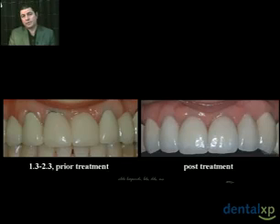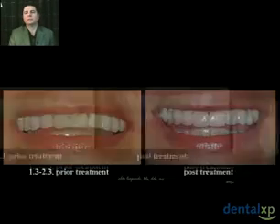In this example for this patient, she has bridge work from 1.3 to 2.3. We're going to replace missing teeth number 6, numbers 9 and number 11 with implants, and teeth number 7, number 8 and number 10 with regular porcelain fused metal crowns. The objective is these restorations need to be indiscernible from each other, and utilizing a customized abutment technique we were able to achieve this result.